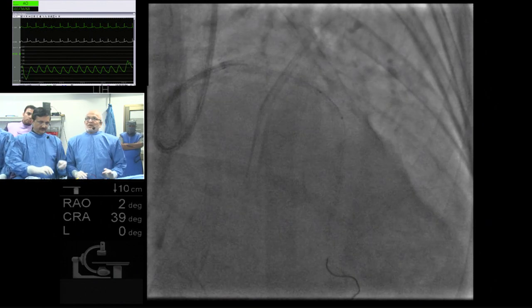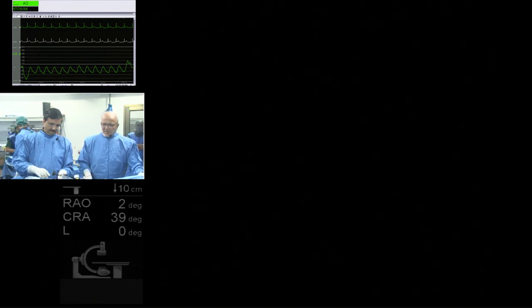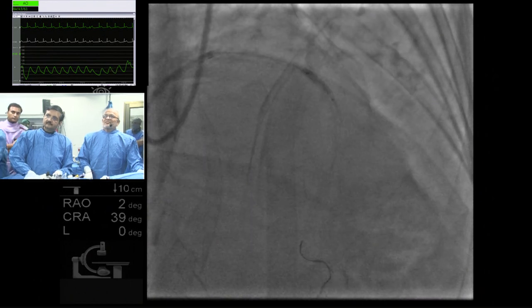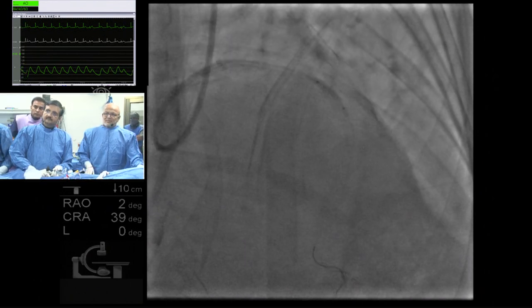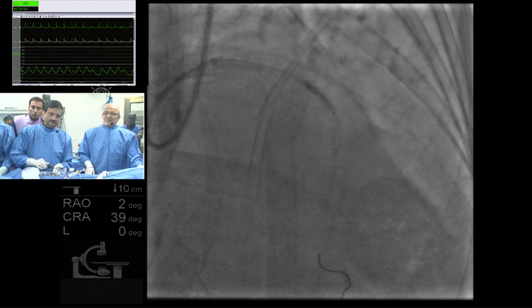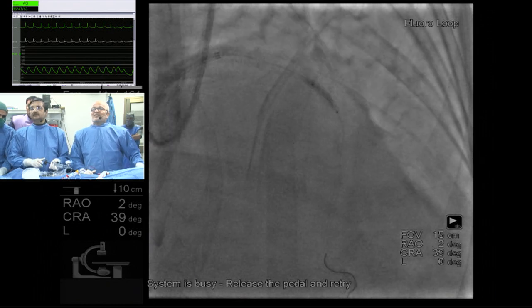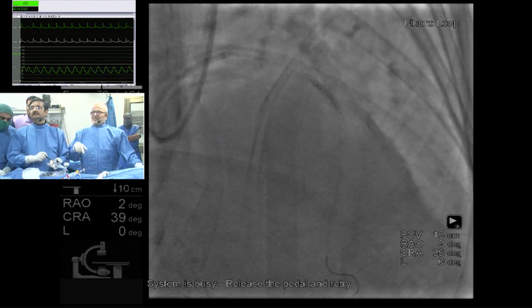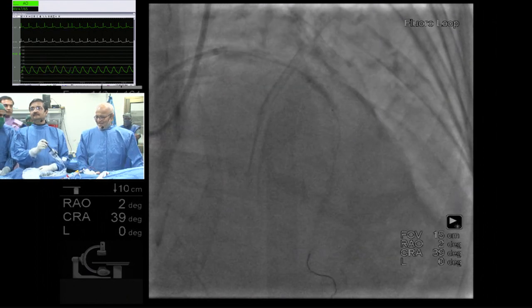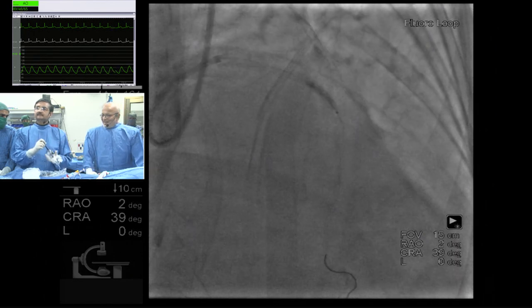Okay, it is moving like a regular balloon. It means that things will be fine. Yeah, and the vessel is well prepared. Here you have a little bit of a waist still. Only four, but if you go to six, let's see. Six, eight. You go to eight. Do I see air in that balloon? Yeah, there is a little bit of air this time. Oh my God, you don't like to see that. You get the air out.